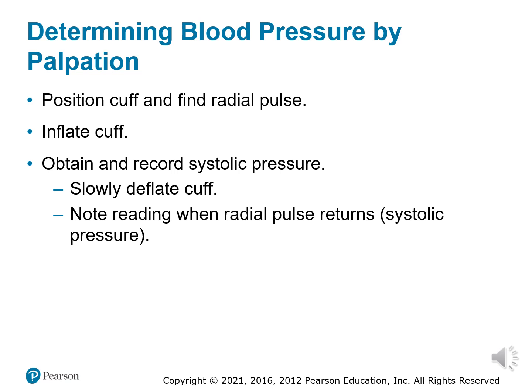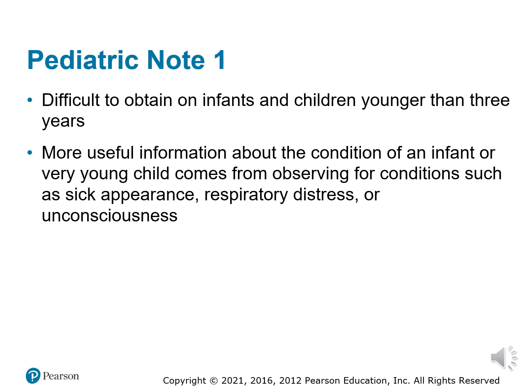This is not the best blood pressure, but it is something if you don't have a stethoscope, or if you're in a loud area, or if you just can't hear it with the stethoscope and so forth, then you can try this.